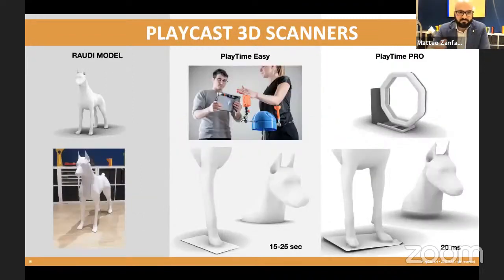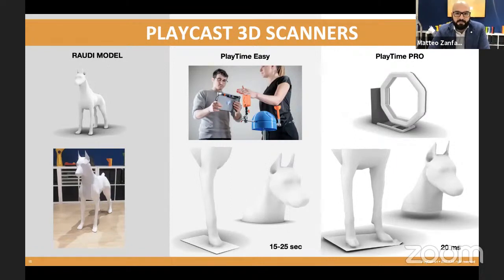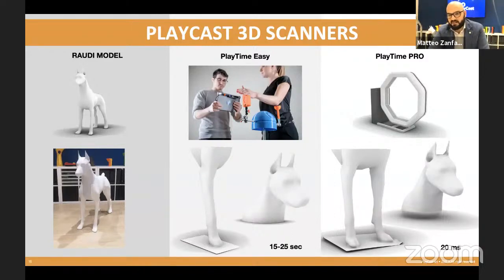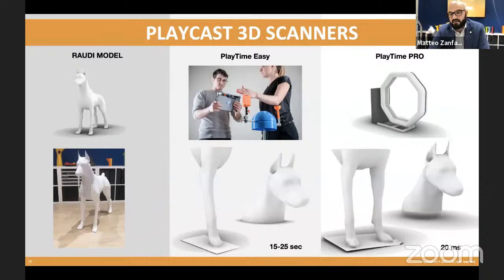What about the scanners? This is Rowdy, our fake dog model, used to compare the two systems. At the moment, we are using PlayTime Easy, which is based on an iPad and Occipital sensor — our own software manages how the information is prepared and processed. It takes 15 to 25 seconds to achieve this quality. The PlayTime Pro, which we already use in the human field, takes less than a second to produce a very detailed and complete scan.